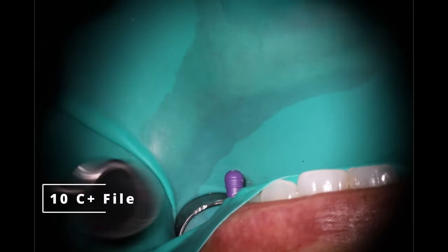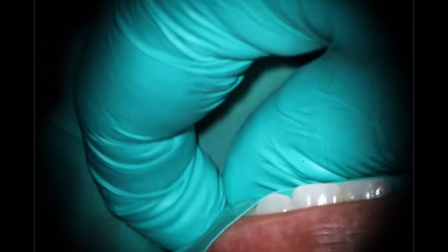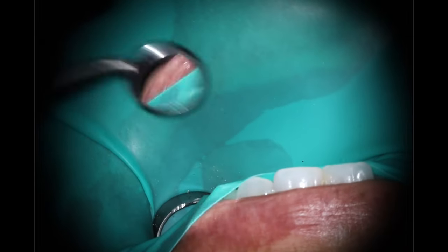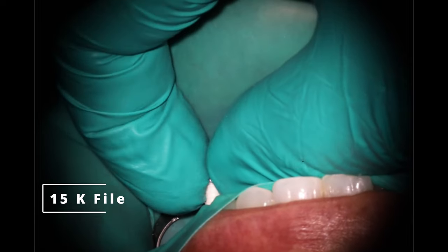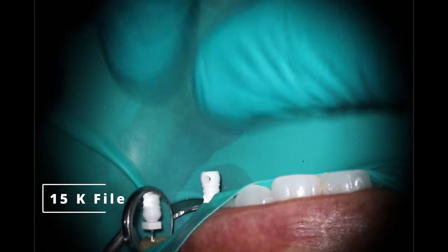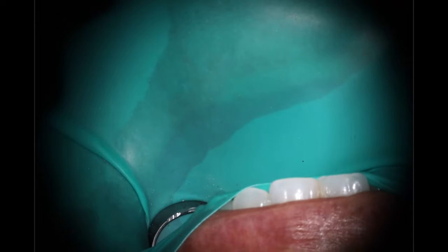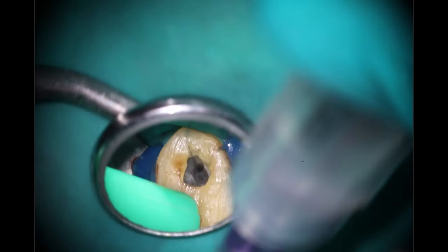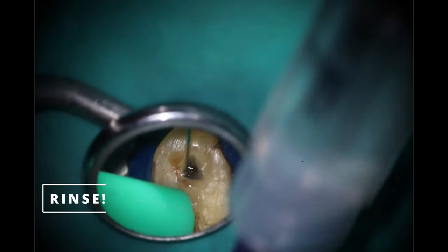As long as you still have that nice little stick, you know you're within the canal and you can open it up. So we're just going and hand filing — just like they taught you back in dental school. Sometimes rotaries are great, but you still need to know how to hand file and go back and do your basics. At this point I'm slowly enlarging the canal using these hand files. I like to get up to a 15 K file in a case like this that's pretty curvy and has a little bit of calcification — the reason why is it gets space for that 17.